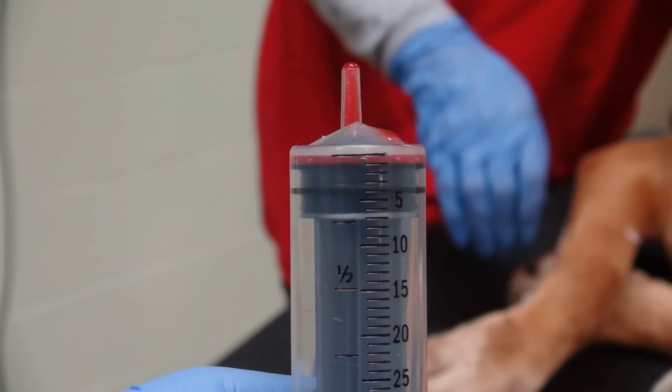Here is the diagnostic sample with the air expressed out. In a clinical patient, the sample would typically be distributed between at least a small aliquot for cytology and another for culture and sensitivity. If multiple syringes with multiple samples were obtained, there will be plenty for additional tests such as special cultures for mycoplasma or other fastidious bacteria.